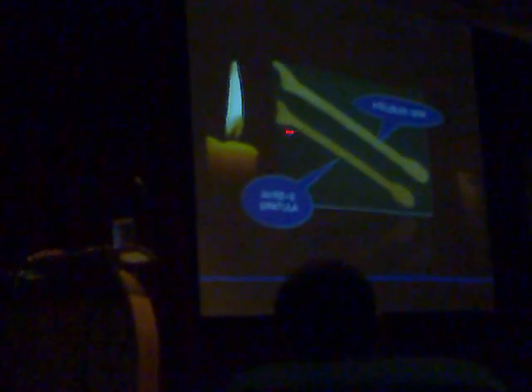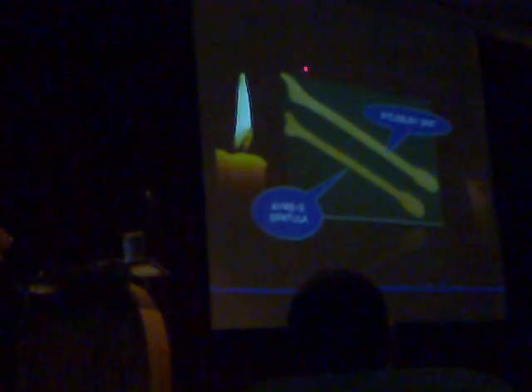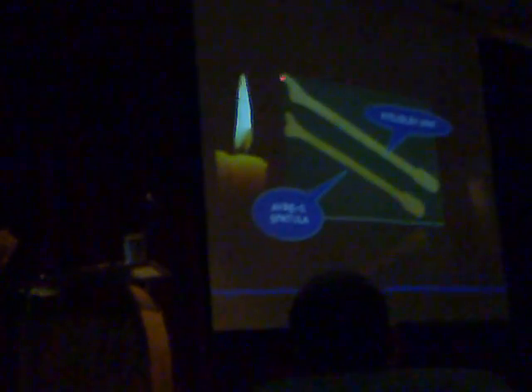Here, this is the Ayre spatula and the Aylesbury spatula. What is the difference? The tapered end here produces an endocervical sample better than this. So it is suitable in postmenopausal women where the transformation zone and squamocolumnar junction are high up. While this is suitable for multiparous os where the transformation zone is wide. So we can use the spatula according to the situation.